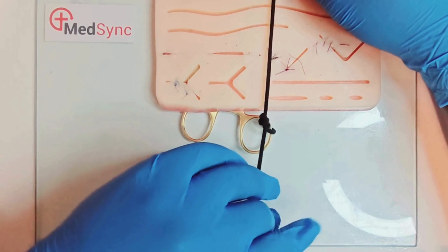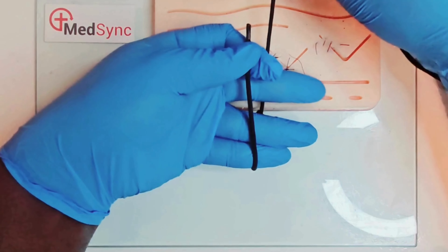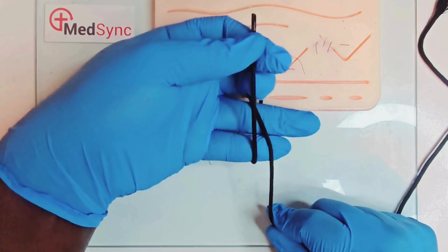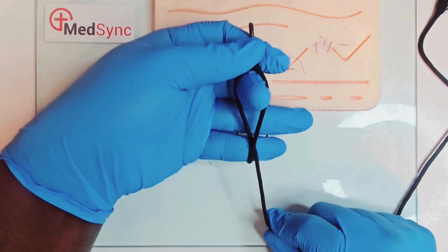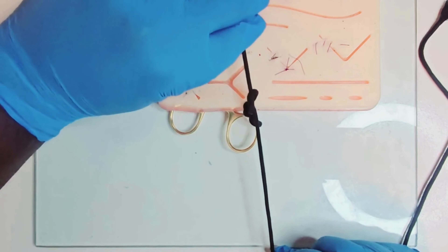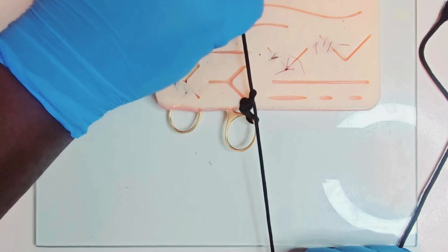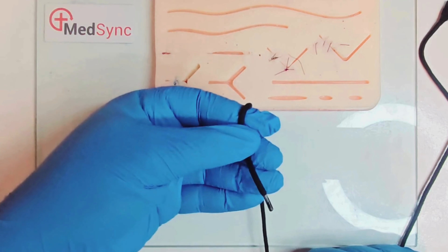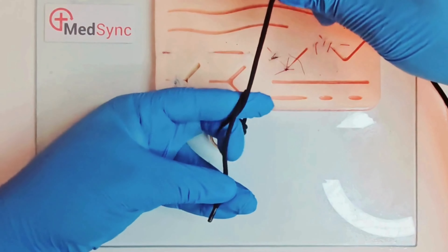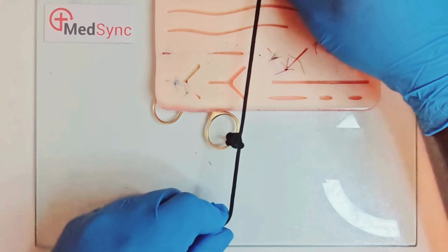Grasp the short thread between index and thumb, turn your palm up. With the short thread running up, run the long thread down your left palm. Flex the middle finger, squeeze the short thread between middle and ring, release the pinch, and pull the short thread away from you. Now run the short thread down your left hand, grasp it between thumb and ring, and push your index and middle fingers away, running the long thread up. Flex the middle finger, squeeze the short thread between index and middle, and pull toward you.